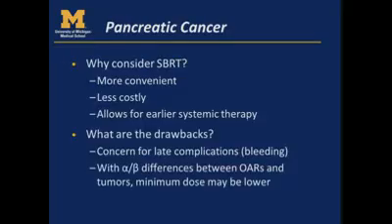So I'm going to move on to pancreatic cancer next, and then after kind of an abdomen session, I'll turn it over to Martha to talk about abdominal considerations for planning. So for pancreatic cancer, why even consider SBRT? It's much less commonly used than for liver cancer, but the rationale would be that it's more convenient, less costly, and allows for earlier systemic therapy.